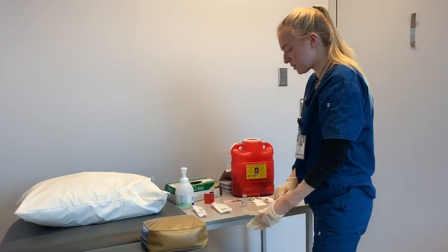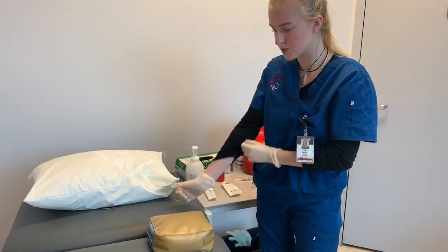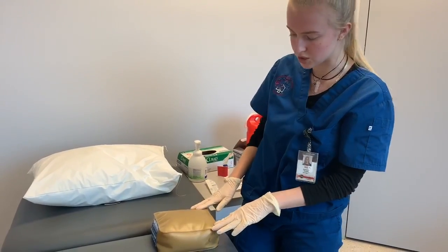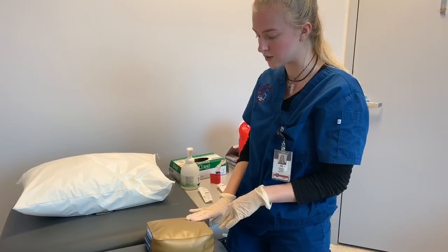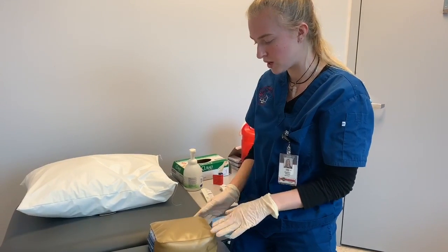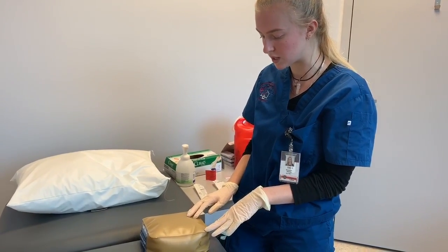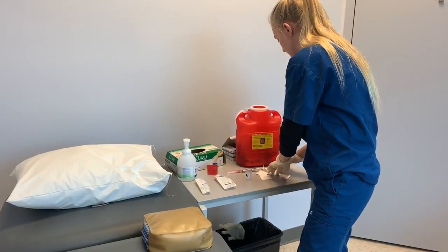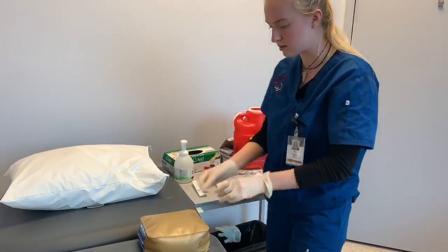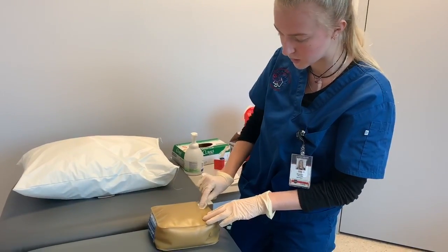Okay, so I'm going to do an inspection of the patient's deltoid muscle. So I don't notice any lesions or masses. I'm going to administer the injection 3 finger lengths from the acromion process. And we're doing the injection in the deltoid muscle because we're administering less than 2 milliliters of medication. So first, before doing my injection, I'm just going to clean the site. I'm going to clean it in a circular motion for about 20 to 25 seconds.